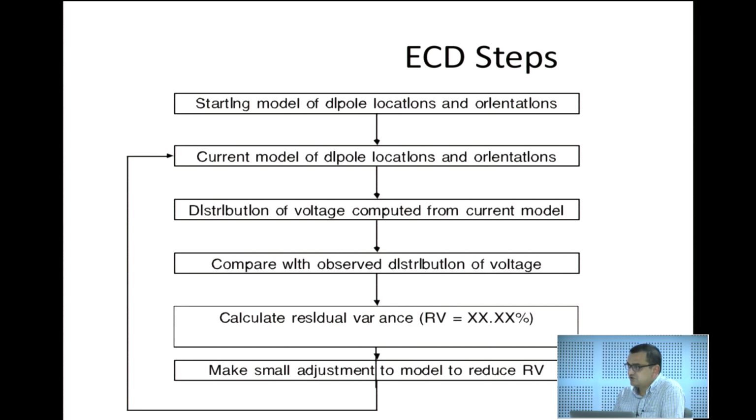Yes, all 32, 64 points, because as you know on the scalp, even if electrodes are far apart, they are still picking up some activity from your location. So yes, you have to observe the whole scalp.